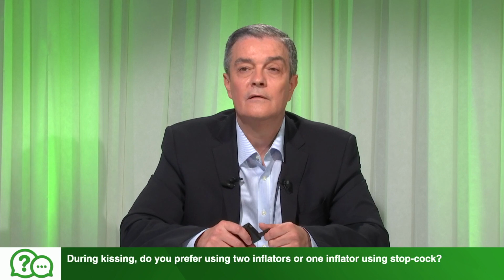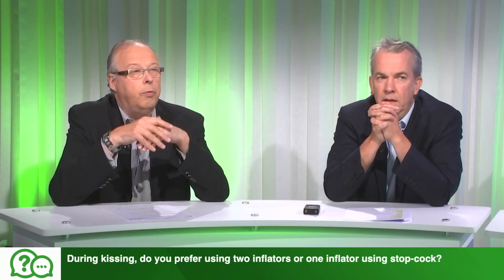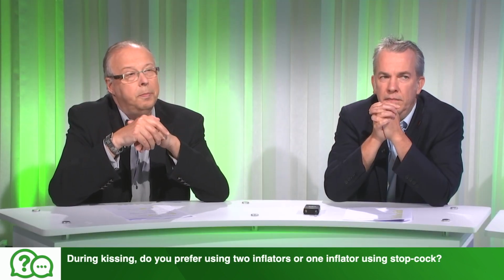Yeah, there are just coming more questions about kissing. During kissing, do you prefer using two indeflators or one indeflator with the stopcock? I use two indeflators because I'm not always using the same pressure on the two balloons. Yeah. Okay, so that's very important technical advice. Dave, I hope you agree.